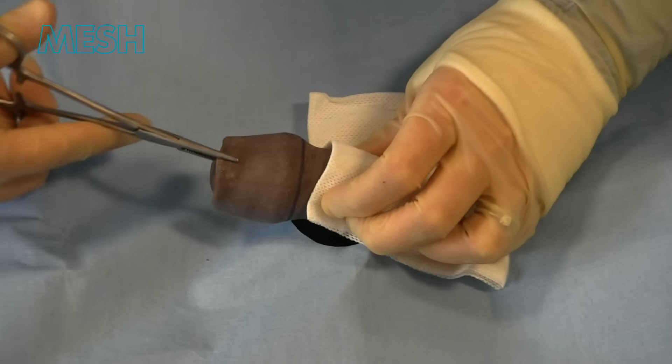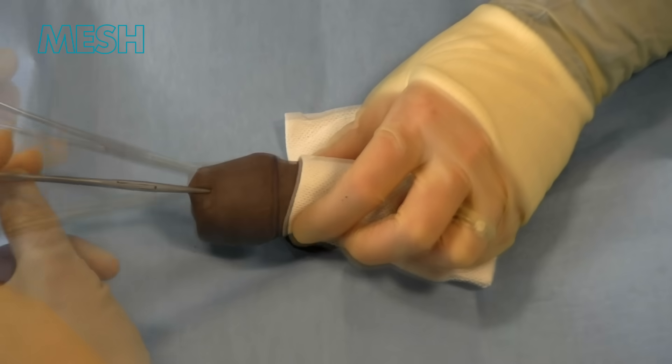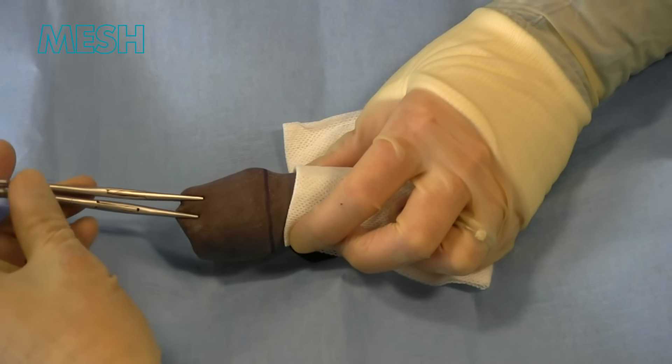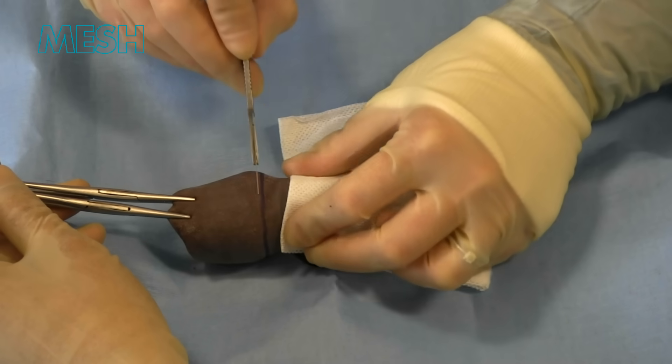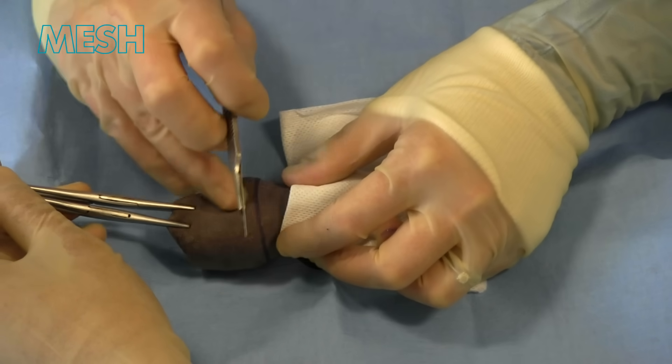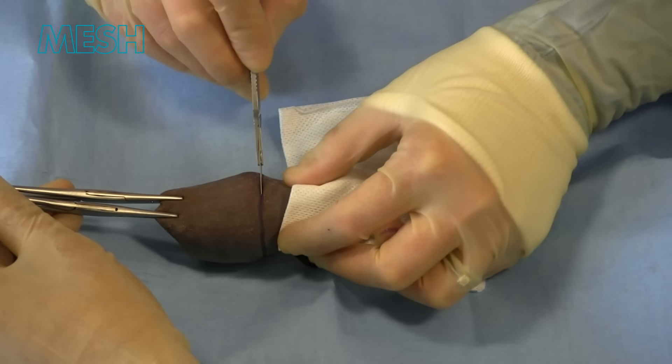At this point it's useful to place two clips onto the foreskin. This allows your assistant to help with retraction. A swab in the left hand allows sharp dissection. Here we are using a 15 blade.